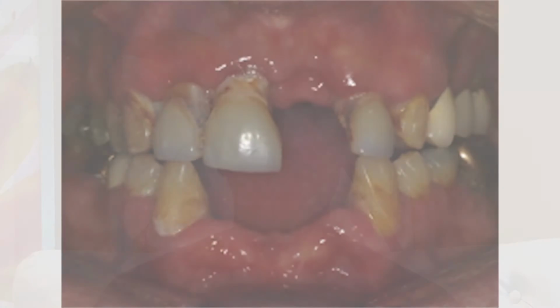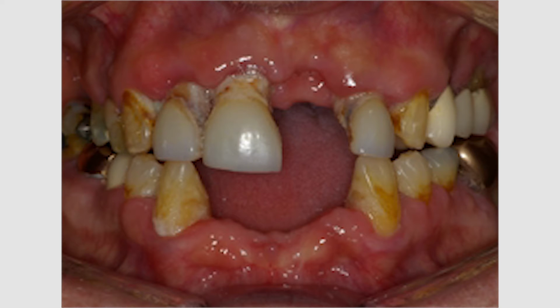As you have a loss of that foundation, it just makes a deeper pocket. More bacteria fit in, more poisons are released in the gum tissue, and now more bone loss occurs until those natural normal bacteria we all have in our mouths cause tooth loss. The idea behind this procedure then is to selectively remove the bacterial aggregations from beneath the gum tissue.